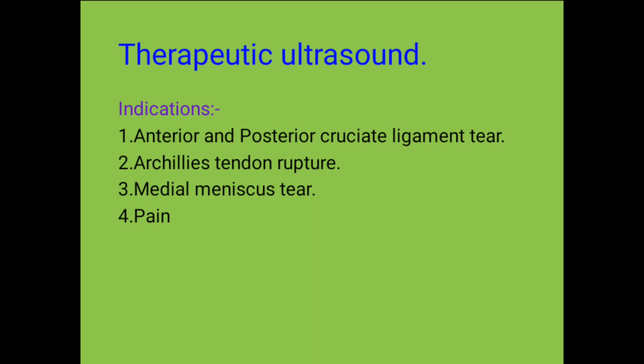Again, there is the medial meniscus tear. We get to understand there is pain. And when we talk of pain, you need to be in a capacity to explain the mechanisms through which ultrasound will reduce pain. Maybe it might even reduce joint stiffness, or relax tense muscles. It will reduce pain and even increase blood flow. Yeah, those are some of the ways.